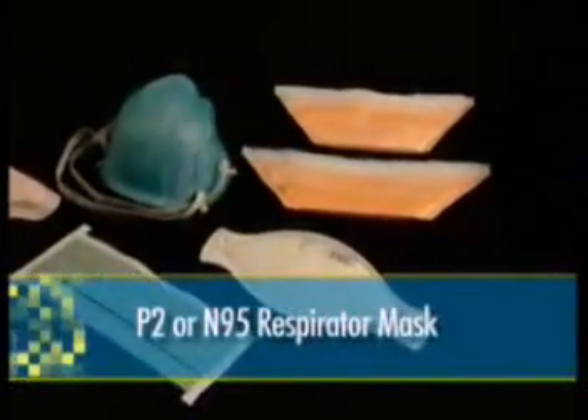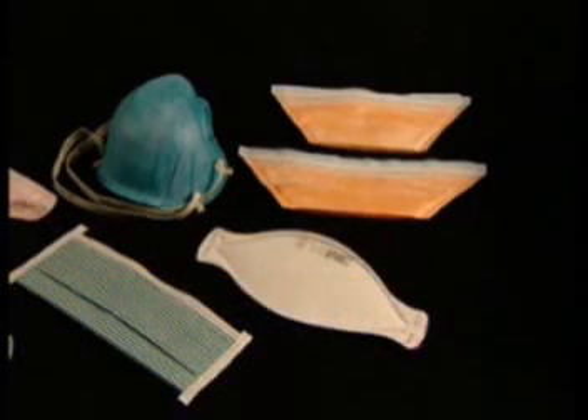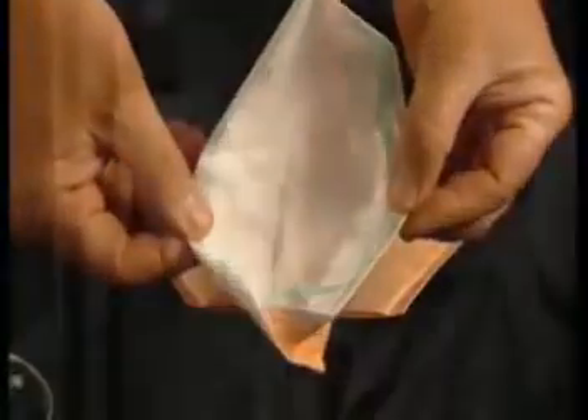When airborne precautions are required, a particulate filter respirator mask is indicated. The P2 mask is the Australian equivalent of the United States N95 mask. Both masks are designed with a high filtration capacity and essentially provide the same level of protection. These masks are significantly different to surgical or standard filter masks.